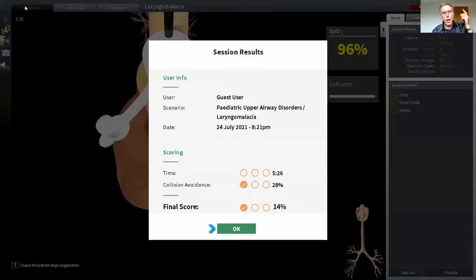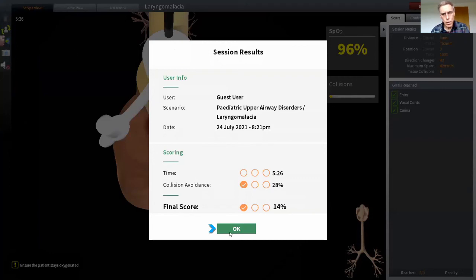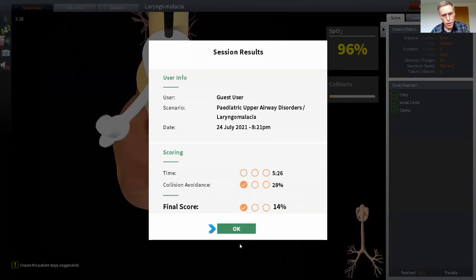And at the end you get a score. That's a low score for me because I took a lot of time giving a commentary, but normally you'd move a bit faster. But also the score depends on the amount of time I took and the number of collisions, and it gives you a cumulative score.